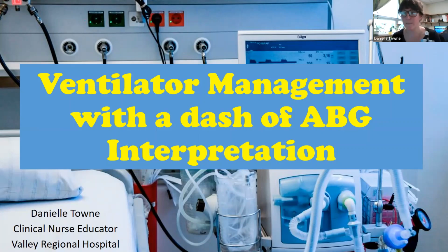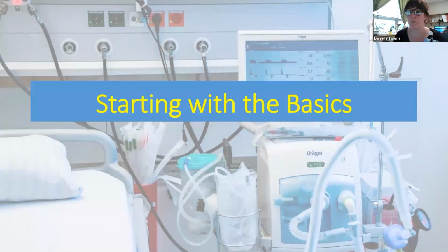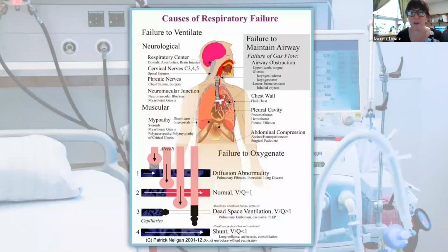Today we're going to talk about ventilator management with a little bit of ABG interpretation thrown in. So let's just review some of the basics. From last month's lecture, we learned that we intubate patients if we have one of four potential problems: a failure to ventilate, a failure to oxygenate, a failure to maintain their airway, or they have an expected clinical course that would require an intubation.